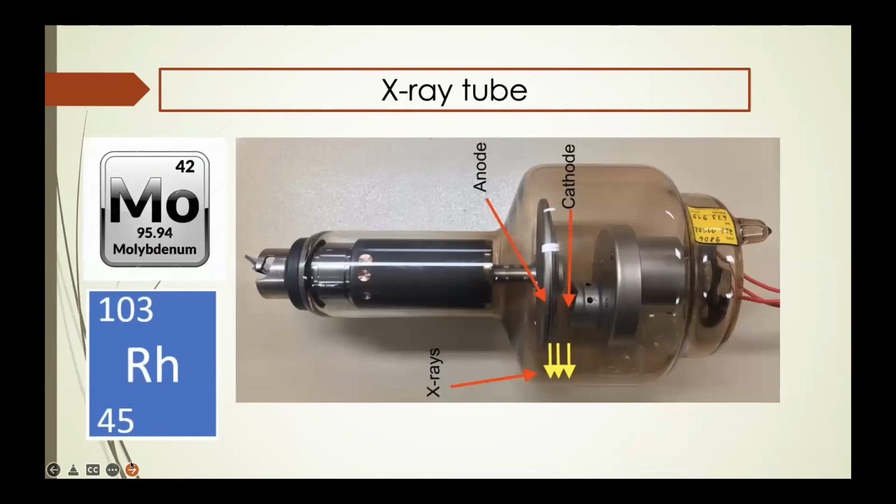So this is how an X-ray tube looks in reality. This is just one example. If you go online, you will probably see other types of X-ray tubes.